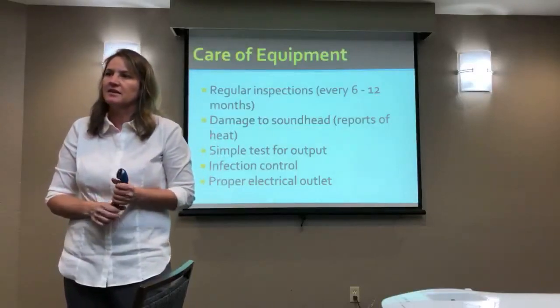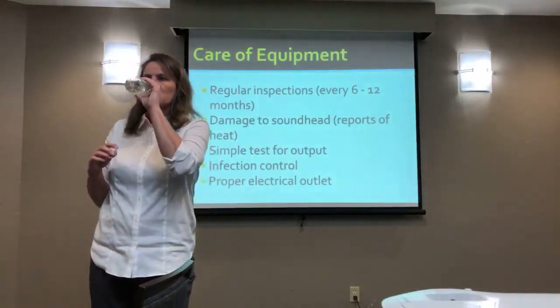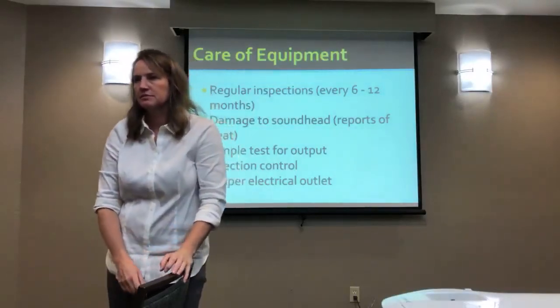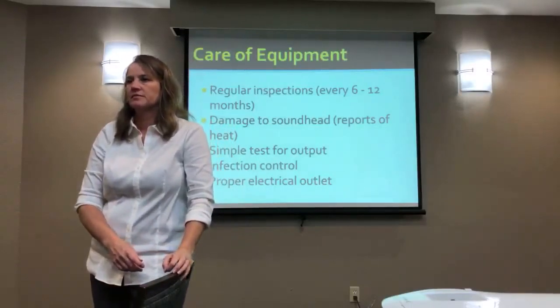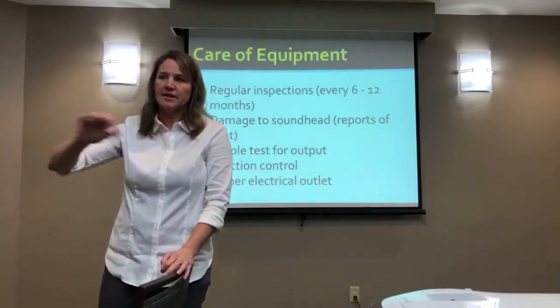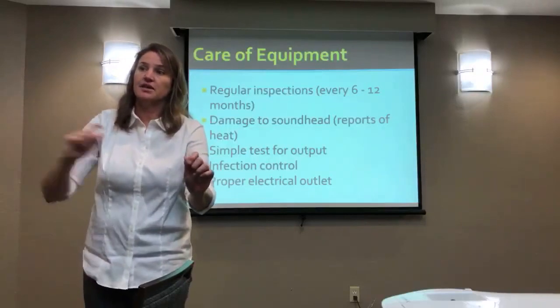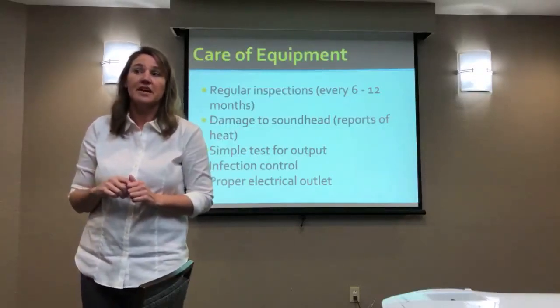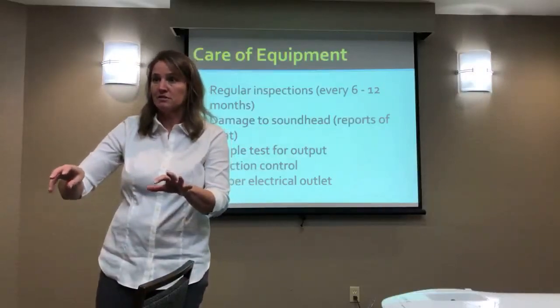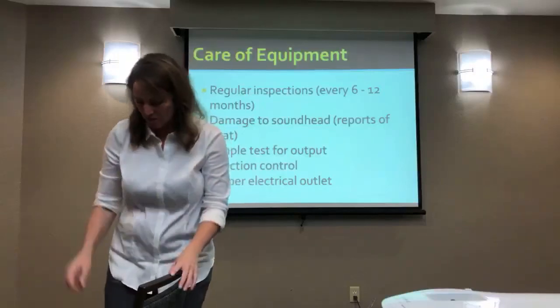Yes. Okay, this might be a stupid question, but because you don't want to expose it to air and all that, do you turn on the machine and do all the parameters and then do the gel and put it on, or do you have to put the gel and all that stuff before you turn it on? So for the setup, I'm not aware of any machine that you can't turn on, get all the parameters set up and ready to go, get your gel on, put it in contact, and then hit initiate the start button. Okay. So I'm not aware of any machines that don't allow you to do that. But you could set up all your parameters first, get your gel on, get it in contact, and then hit start. So these machines back here, that's what you'll do is you'll then hit start. Okay?